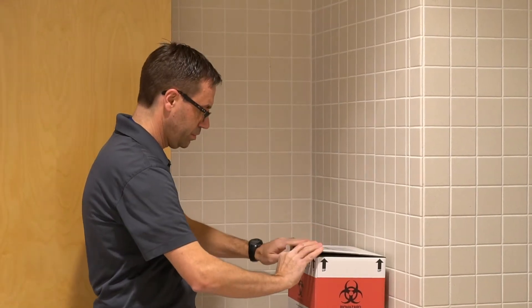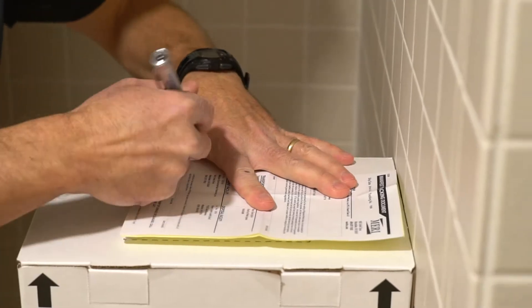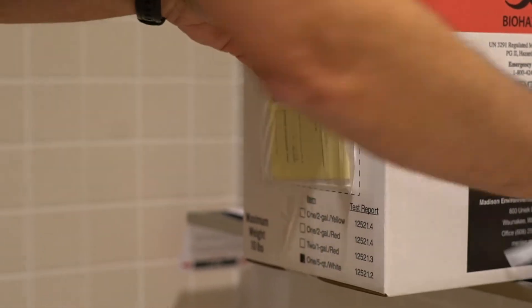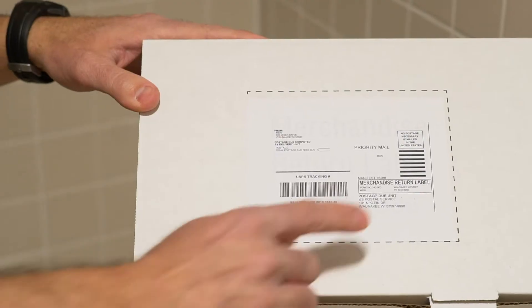Place your full insert into the plastic bag and use the enclosed fastener to twist-tie it shut. Close the flaps on the inside and outside of the box. Sign the manifest on the side of the box and give it to your U.S. postal carrier. We'll send it to a MERI licensed treatment facility.